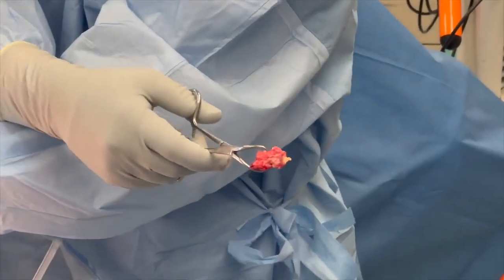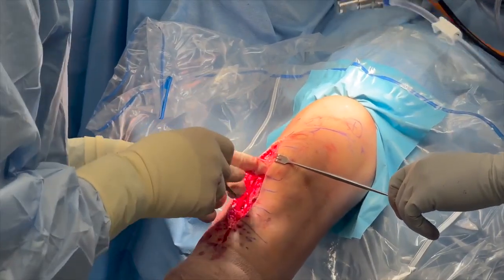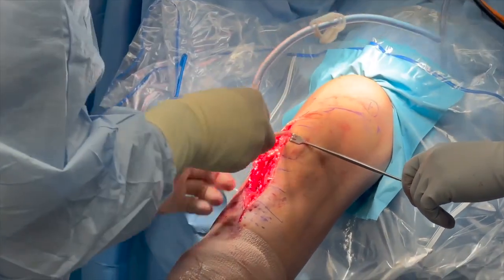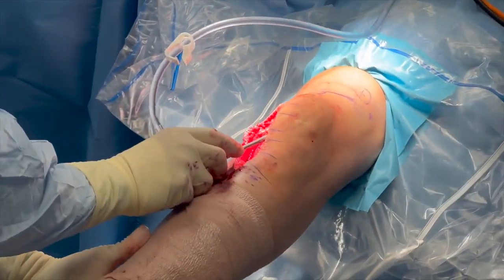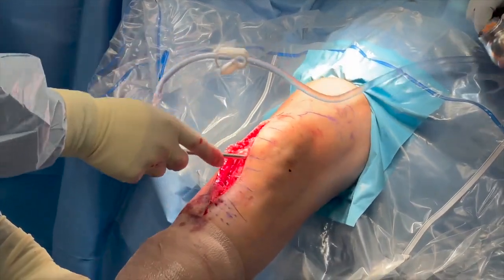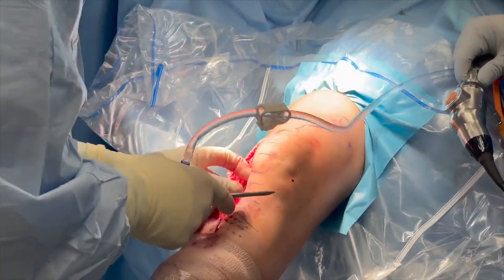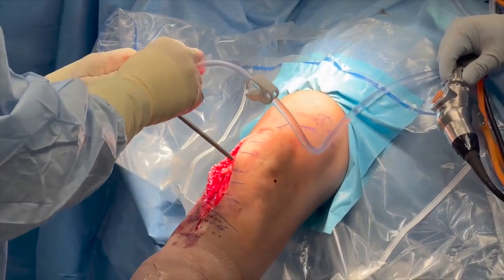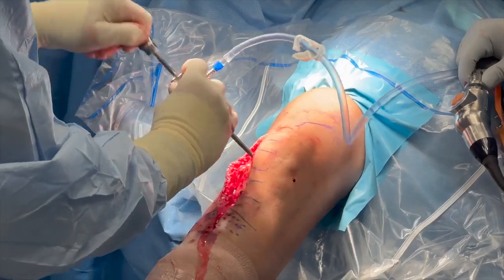Next, a medial portal is created through the open anteromedial incision, and the arthroscope is inserted into the medial compartment just superior to the meniscus. To create the lateral portal, the lateral joint line is palpated, marked with a spinal needle, and incised. Placement of the portals is complicated by the vast amount of scar tissue present in this patient.